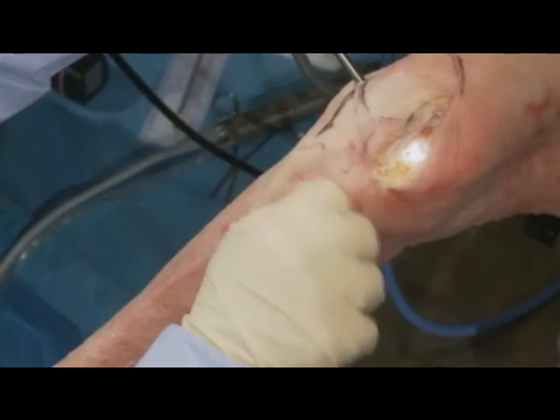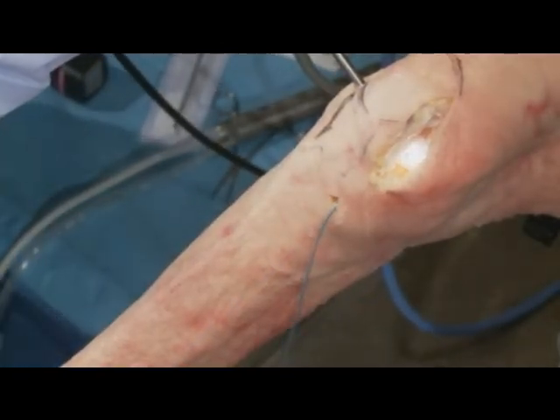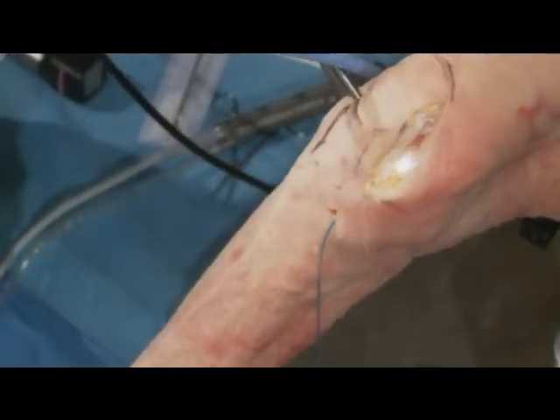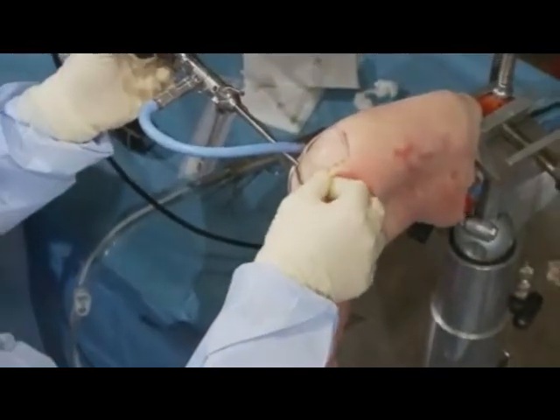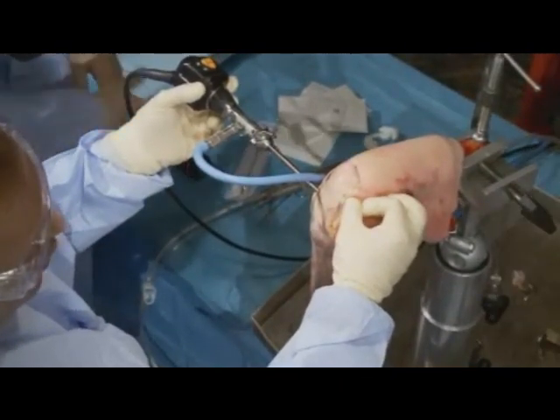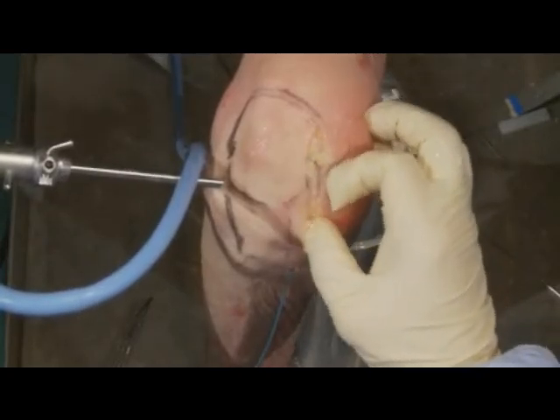So rather than we only have a fixed time here to show you, I think we're going to go to the femoral side at this point in time and leave the tibia at this point, okay? So for demonstration purposes, because you can do this through a smaller incision, but for demo purposes today, I'm just going to make the incision a little bit longer, but usually it comes from about the mid-pole of the patella down to about 5 to 10 millimeters past the joint line, and that's what you need to see.